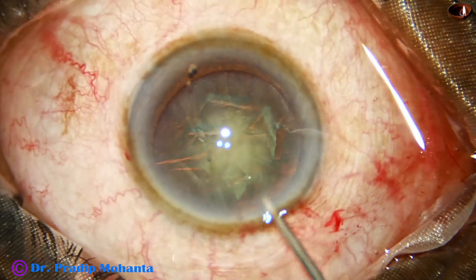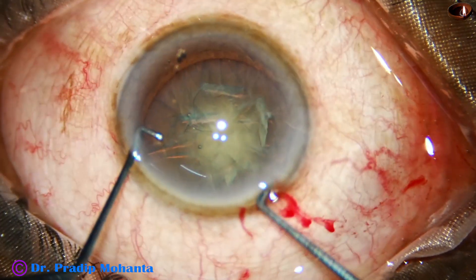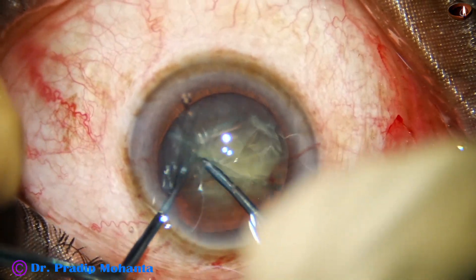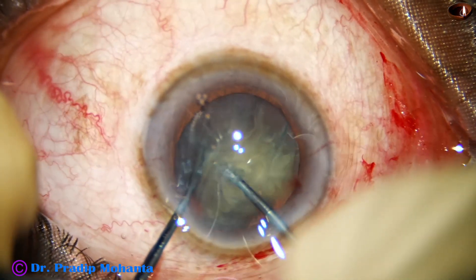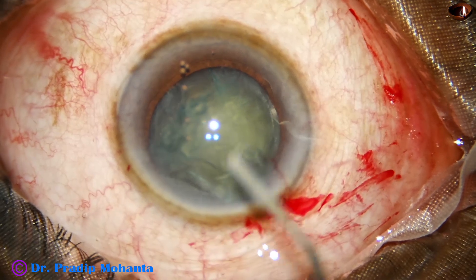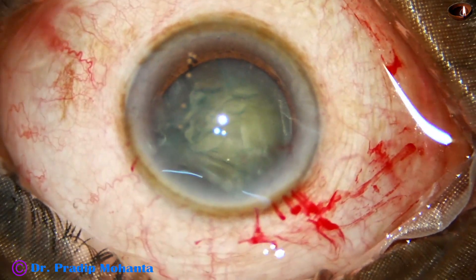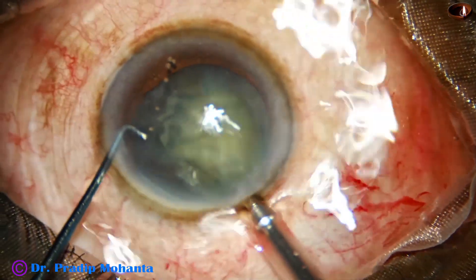The anterior chamber is again filled up with visco and now is the time to use a pre-chopper. I divide the nucleus into two hemi nuclei and again divide one hemi nucleus into two pieces. There is no chance that this manoeuvre is causing the posterior capsular rent because the instruments are measured and smooth.